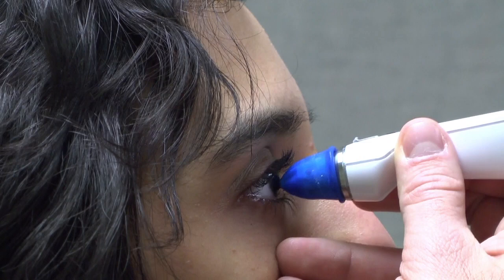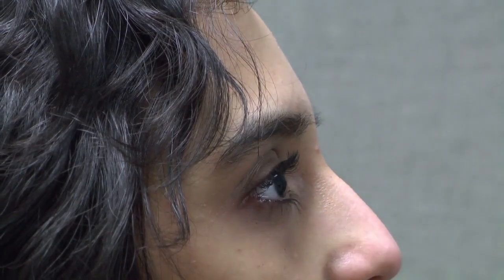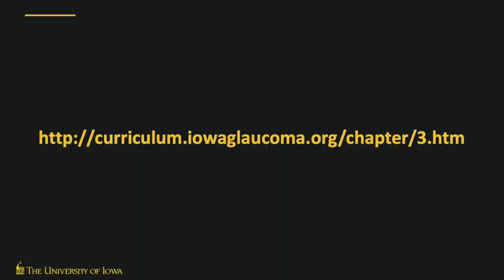If you have difficulty getting a reading, adjust the angle you're tapping on the eye. Should you need to hold the patient's lids open, avoid placing pressure on the globe and pull the upper lid against the superior orbital rim. For more details on various methods used to check intraocular pressure, see the Iowa glaucoma curriculum at the link displayed.